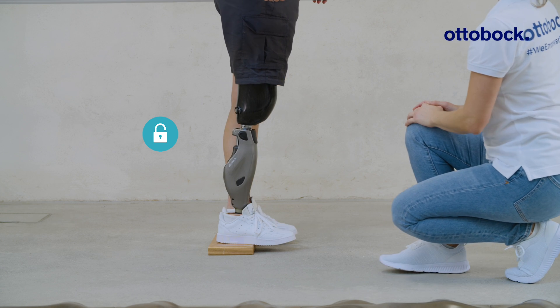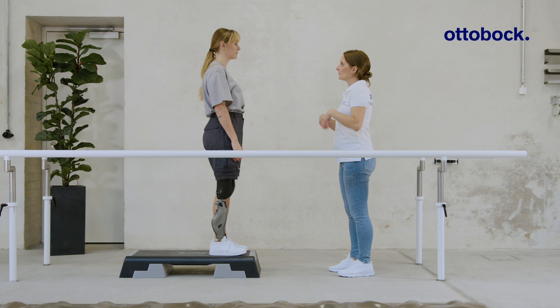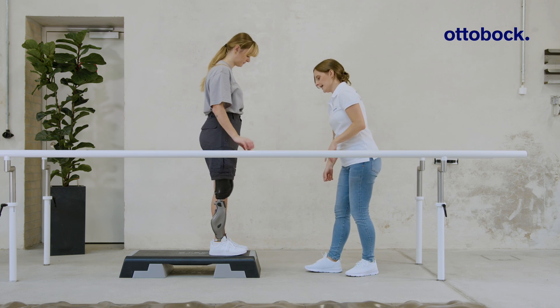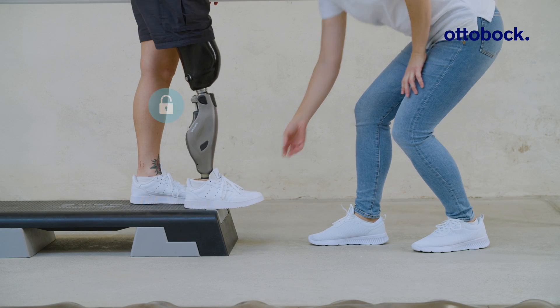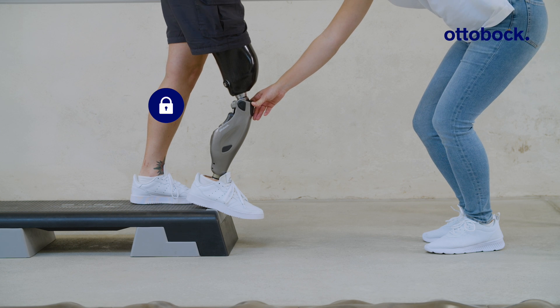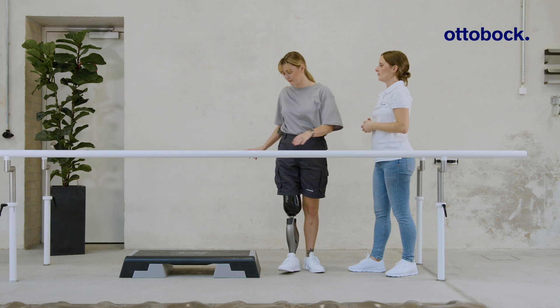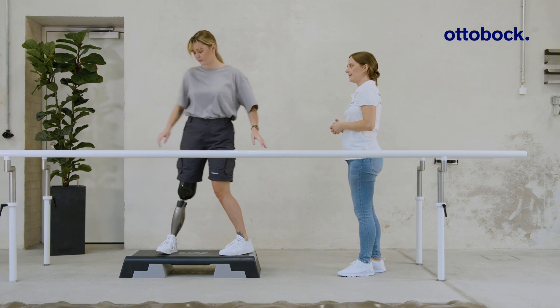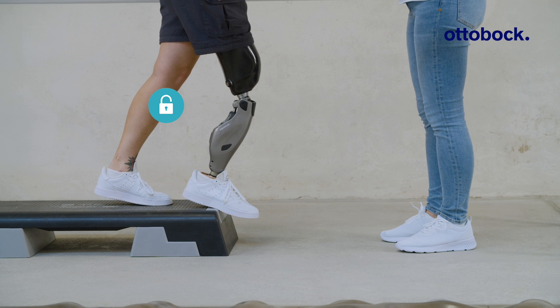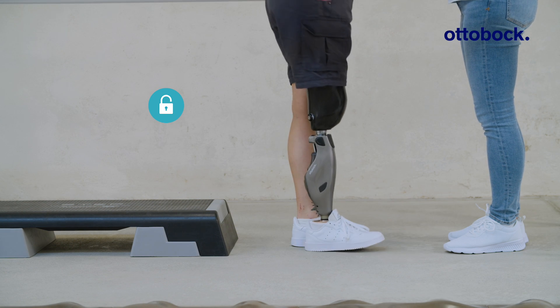Start walking with the prosthetic side. Standing on the edge of a step can activate the stance function. To gain confidence in these situations, practice deactivating the stance function by walking down a step. Have the user stand with the knee joint slightly flexed at the edge of the step so that the stance function is active. As soon as she steps down and moves the center of mass forward, the stance function is deactivated. Remember, this is only possible with an intuitive setting.